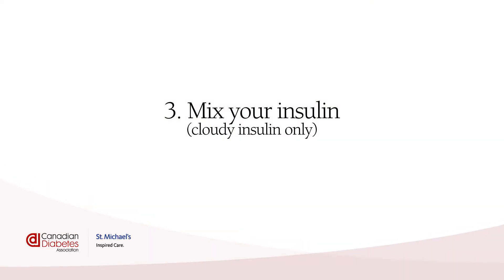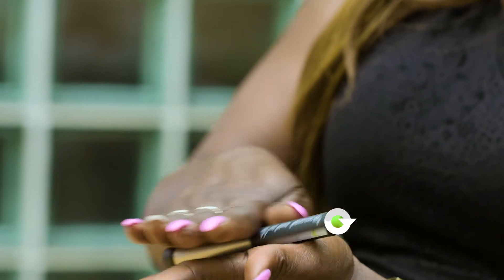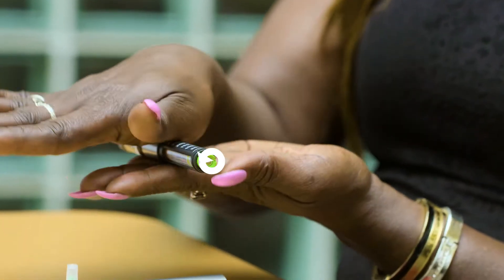Mix your insulin — cloudy insulin only. This step is only needed if you have cloudy insulin. If your insulin is clear, you can skip to step 4: attaching the pen needle.